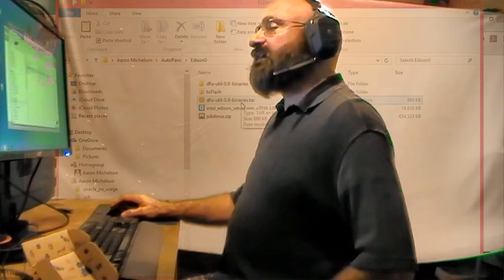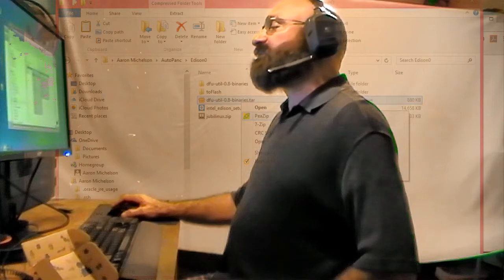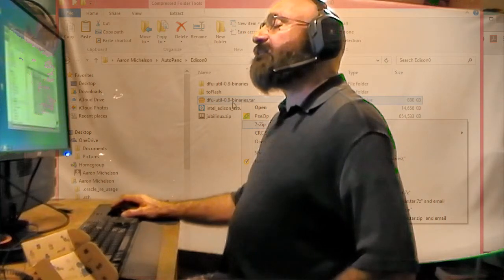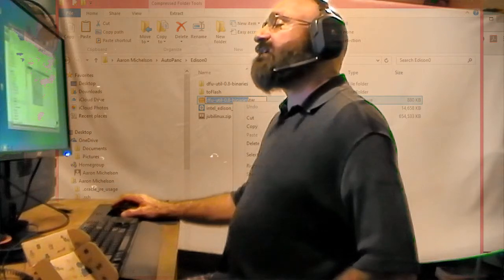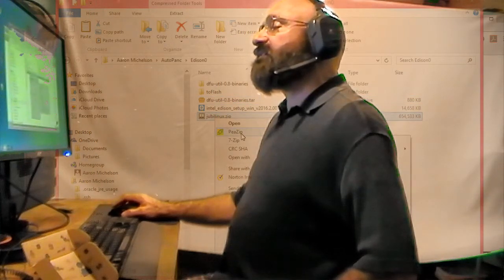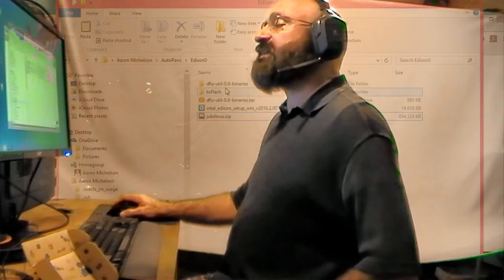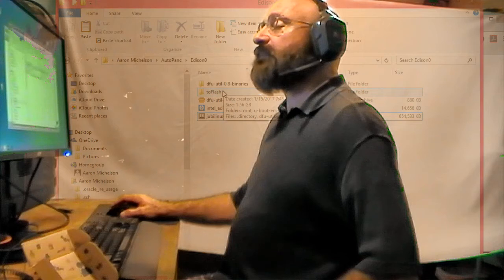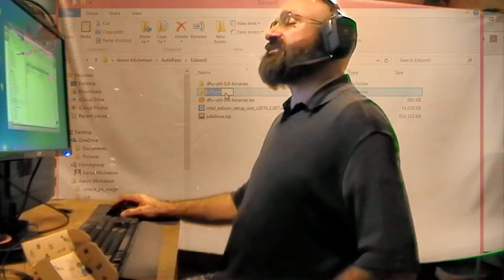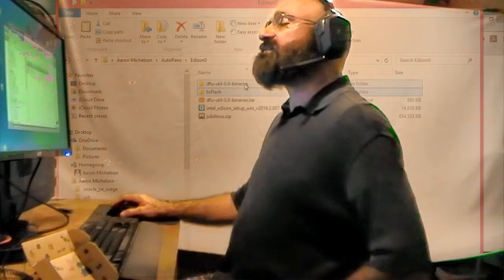So I right click on this and it'll have like a .tz on it, and then I'll 7-zip, extract here. I think 7-zip might do that too. Extract here, and then it'll give you this .tar file, and I do the same thing. Extract here, and then I do that with this ubilinux file. Extract here, and that gives me the zip, so I do that on the zip, and I get these directories. This has a different name, but I just clicked on it because this is the directory I'm going to be going to flash. So I named it toFlash. You can name it anything you want, but I think it's a lot easier.